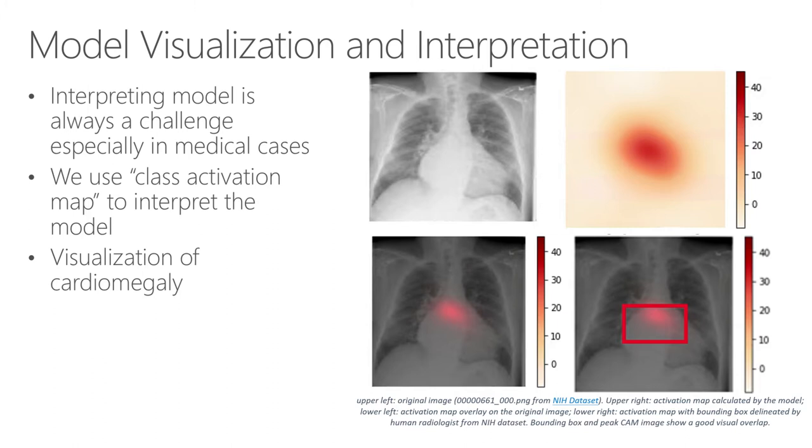And then this is like an overlay of these two images. They say, okay, here it goes wrong. And then this picture, the red bounding box is the ground truth labeled by some radiologist. And then this is the prediction by our model. Oh, I see. So now not only do you have the actual prediction, but you also have where the radiologist labeled the thing. And so you can actually accurately predict where the problem is as well.